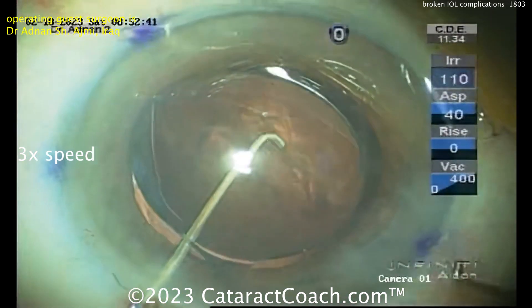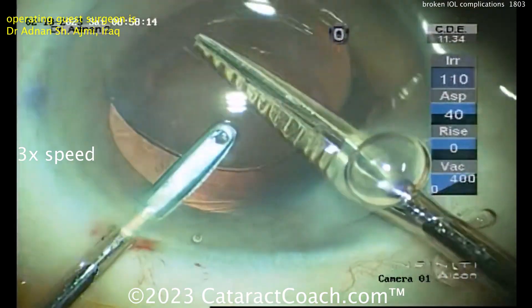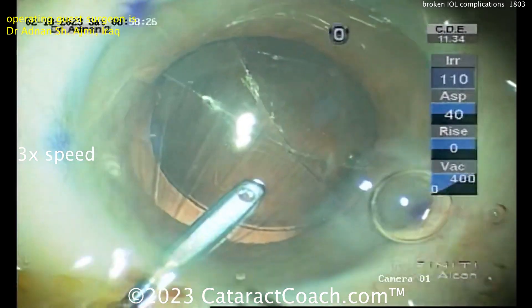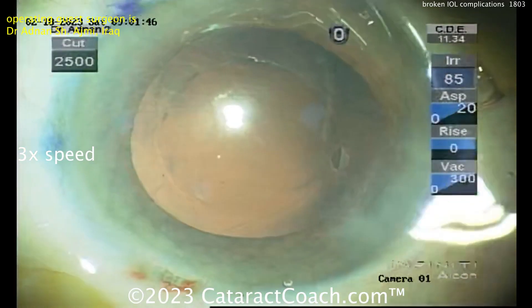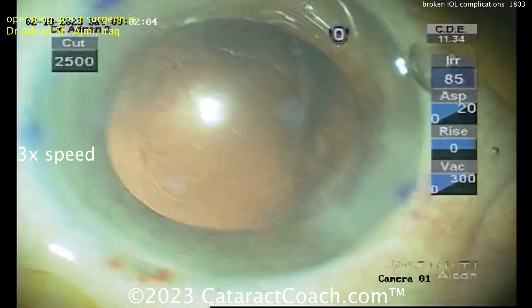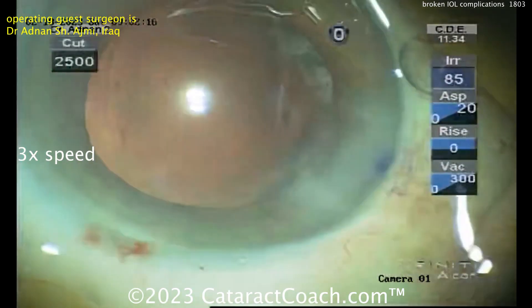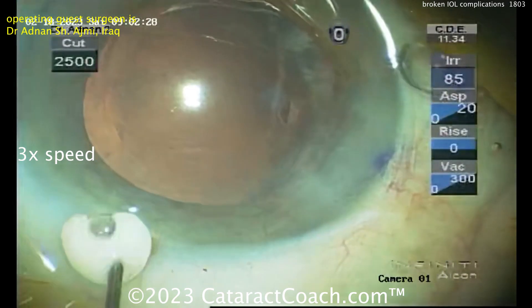Put some viscoelastic underneath it and bring a haptic out of the eye — you want something to hold on to so you don't see this fall further into the mid-vitreous. You don't need to cut the lens fully in half. If you're going to cut it, just cut it 80–90% of the way through so the two pieces stay joined and you won't lose them. Now you've got an open bag and the old lens is out. You're not going to leave that single-piece acrylic lens in the eye with an open bag.